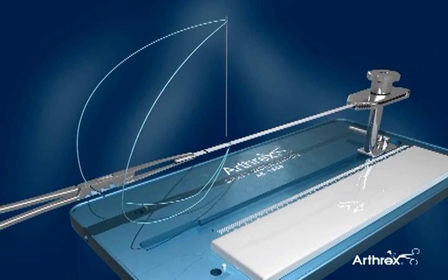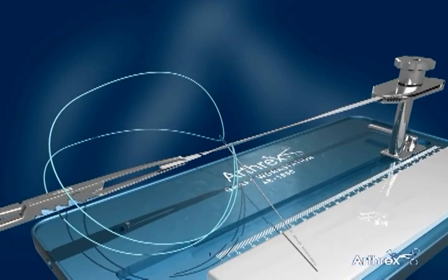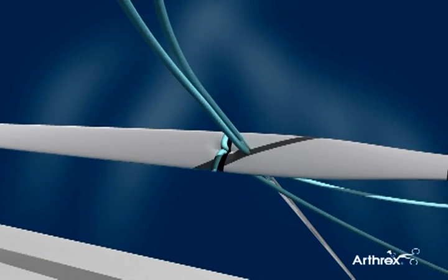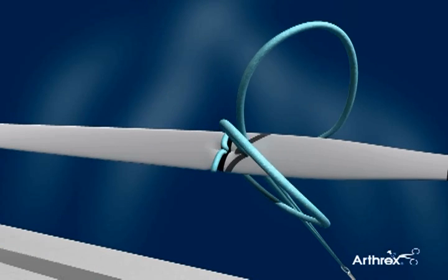Between each pass, the clamped graft end is dropped through the fiber loop as shown. Consistent spacing aids in even construct tensioning.